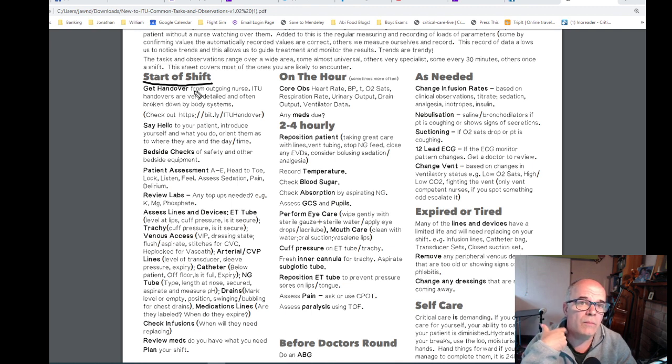Probably. That's the most likely place you're going to find it, on the right or the left. You need to make sure that your drugs are attached to it, the taps are all turned on, and that the drugs are running as you would be expecting them to do. Make sure that it's not kinked anywhere and not twisted. Is the dressing dry and intact? Is that okay? Does that need changing? It might need changing at some point. Possibly not a priority, but it's certainly something you need to be aware of.